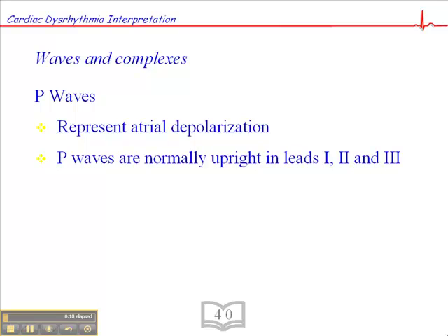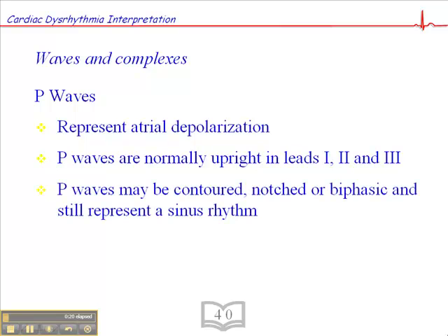And P-Waves are normally upright in leads 1, 2, and 3, and they're typically contoured or rounded. But normal P-Waves may also be notched or biphasic and still represent a sinus rhythm.